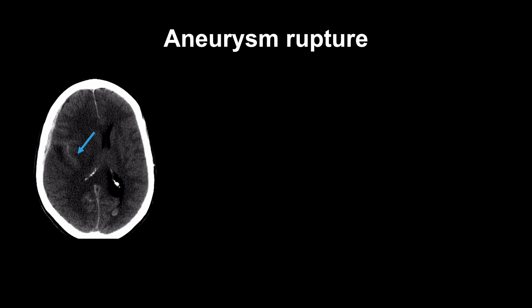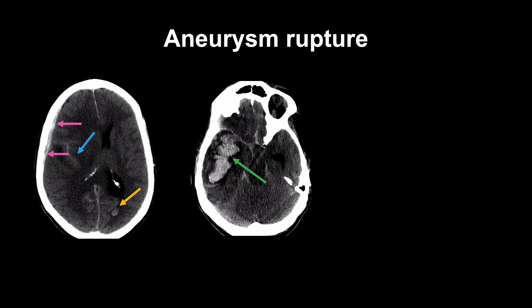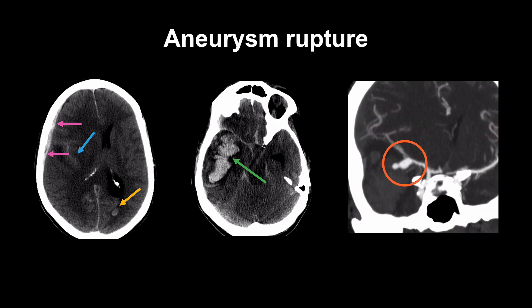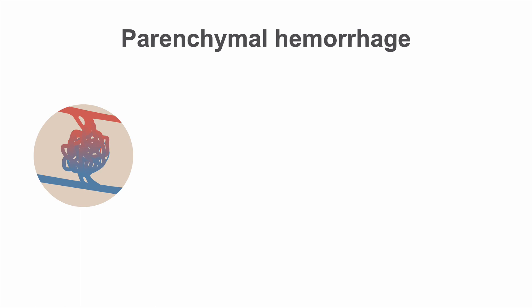Even though subarachnoid hemorrhage is usually the only abnormality evident after aneurysm rupture, in a small percentage of cases aneurysm rupture can also result in intraventricular hemorrhage, subdural hemorrhage, or parenchymal hemorrhage, with or without subarachnoid hemorrhage. In this case, blood was evident in four compartments — subarachnoid, subdural, parenchymal, and intraventricular — after a rupture of a middle cerebral artery aneurysm.